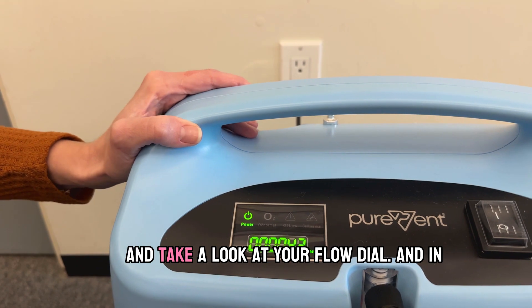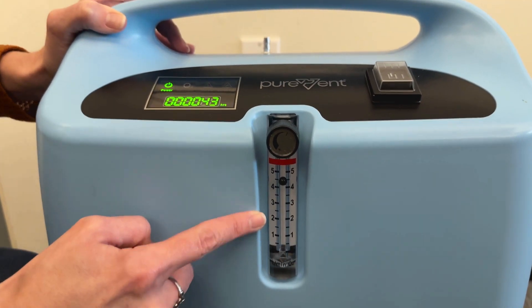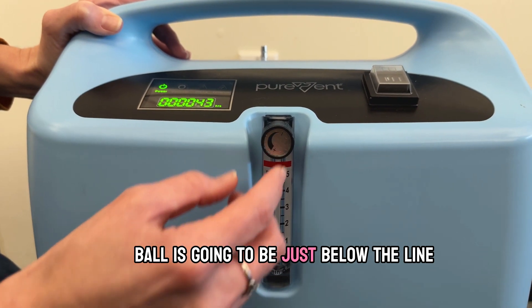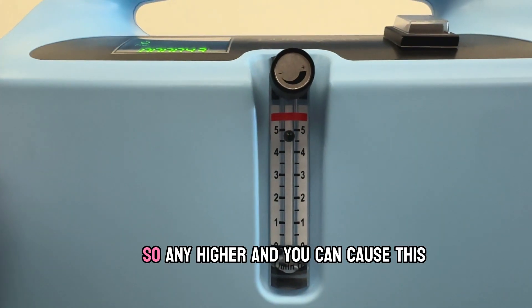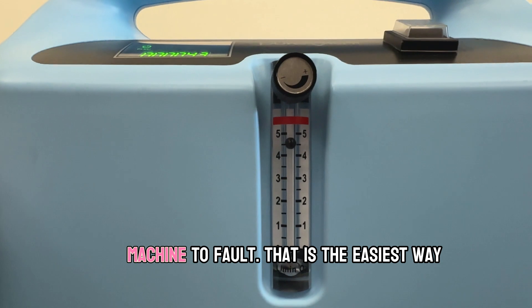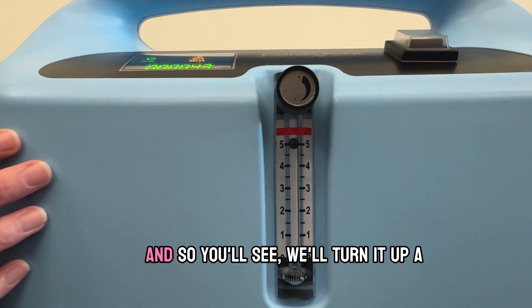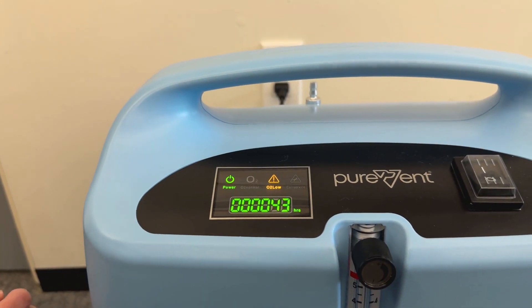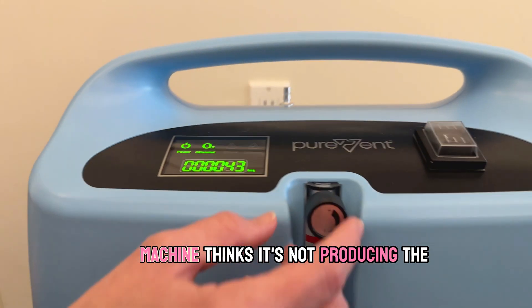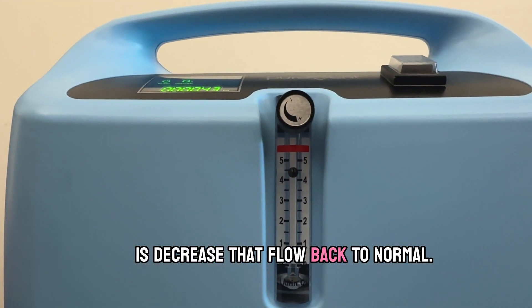While it's warming up you can go ahead and take a look at your flow dial. In this meter you want to see that the ball is going to be just below the line for five. Any higher and you can cause this machine to fault — that is the easiest way to put this into error. You'll see if we turn it up a little too high we immediately go into alarm; this machine thinks it's not producing the right amount of oxygen. All you have to do is decrease that flow back to normal.